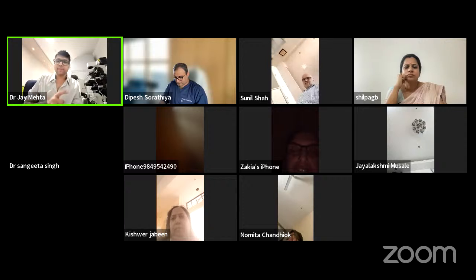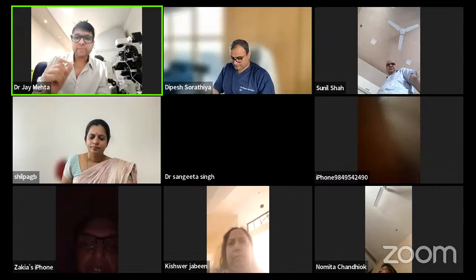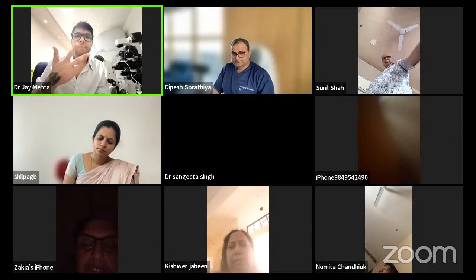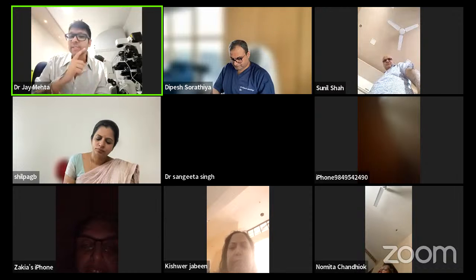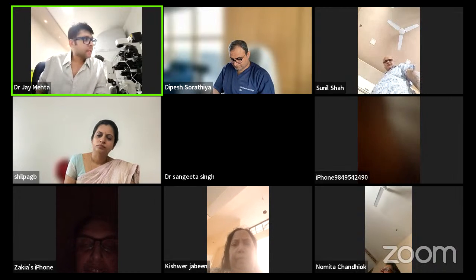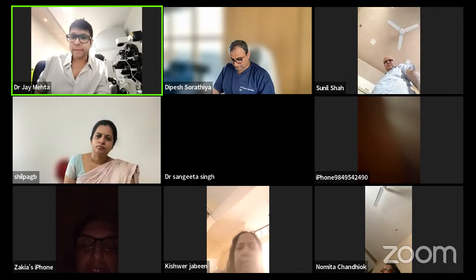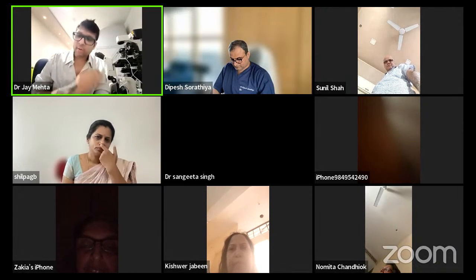As a result, it is very important for clinicians to remember that embryo transfer of approximately 3 day 3 embryos is going to give you equivalent outcomes to one blastocyst which is completely expanded. Many times people have these debates and keep calling me, because I have been a traveling embryologist to many places, saying, Jai, for this patient I have just day 3 embryos and I want to transfer day 3.